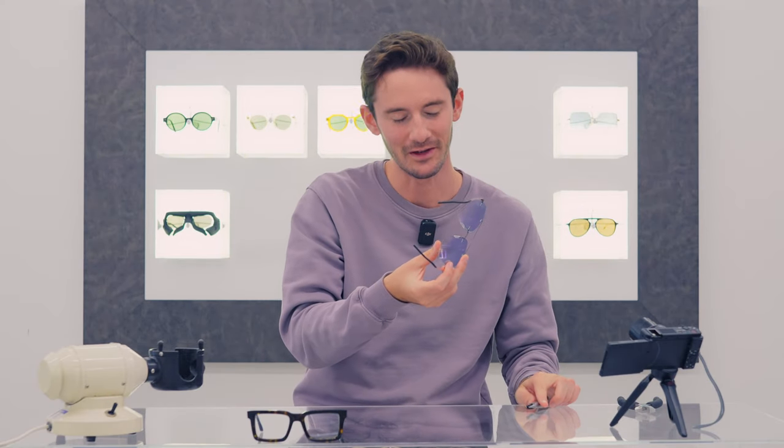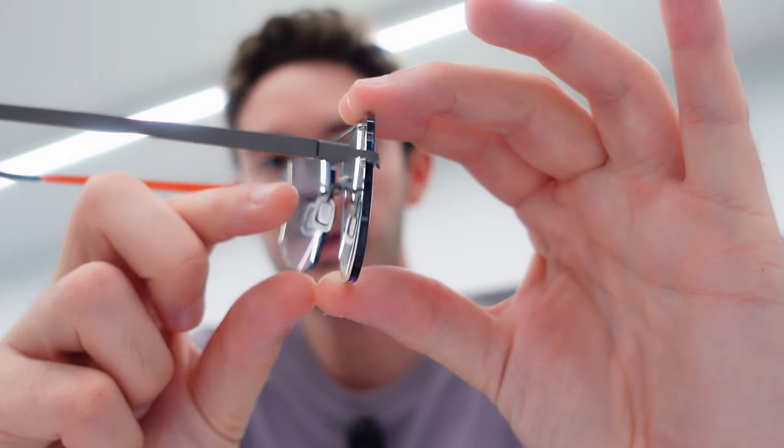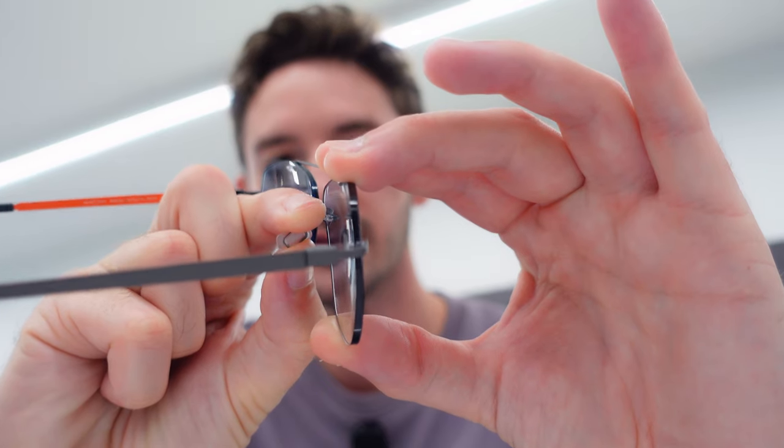A little extra tip: if you want to get both the bottom and the top of the lenses away from your face, what I'm going to do is just bring these backwards. That is going to push all of the frame well away from my face. You should see now that there's quite a lot of clearance between my face and the lenses.